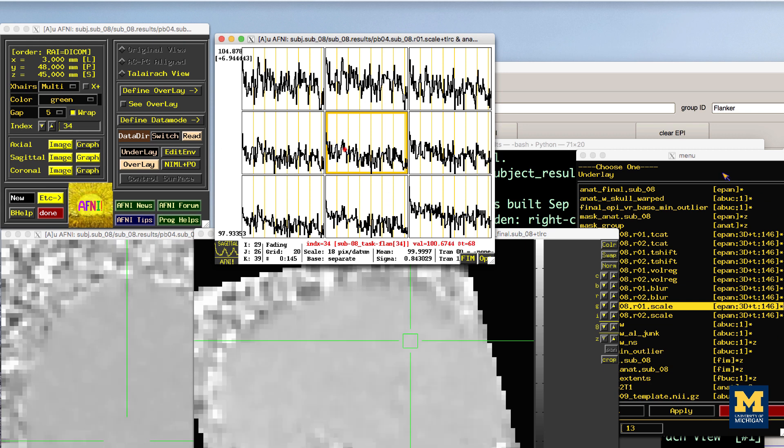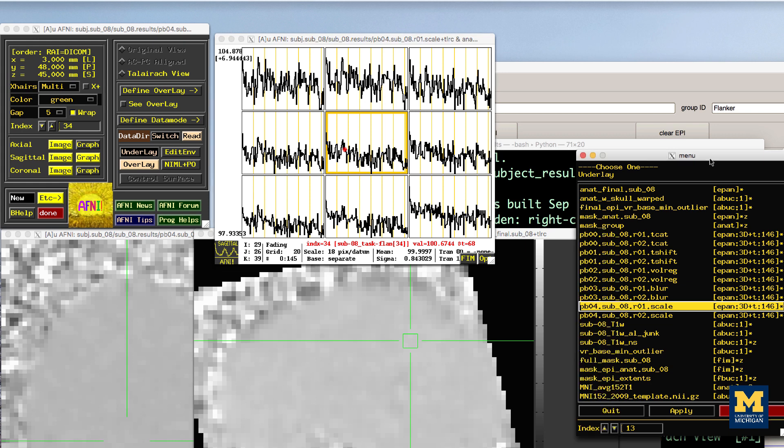In addition, AFNI creates a mask that excludes any non-brain voxels. The mask is binary. It will contain ones in the voxels that are determined to be within the skull and zeros outside of the skull.